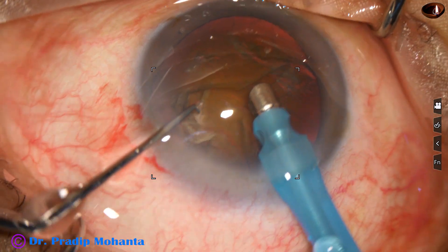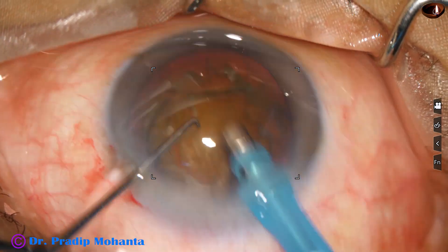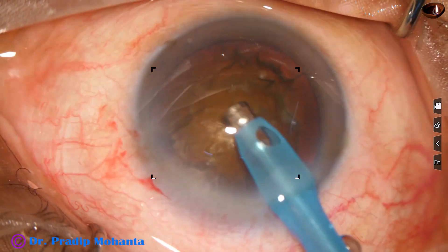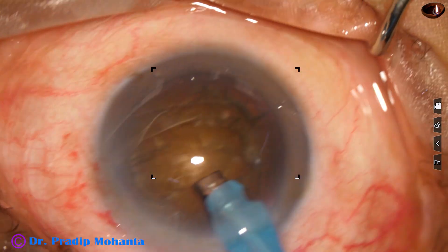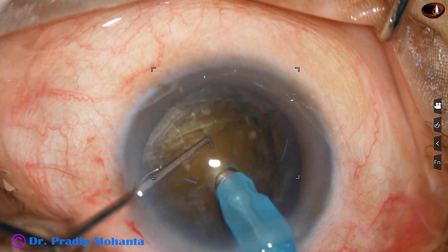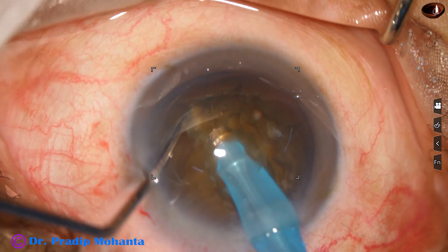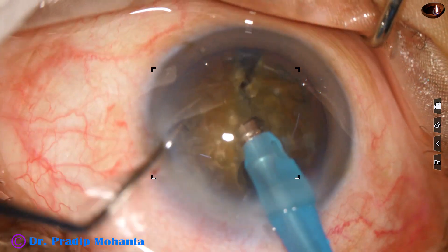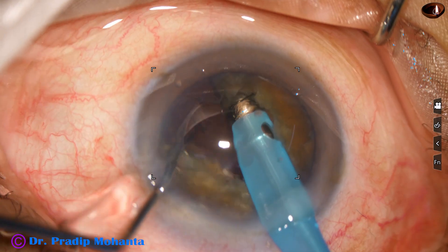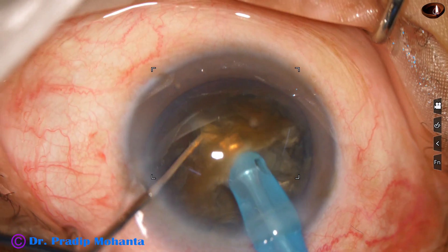Some superficial cortical lens matter is removed. Then the handpiece is turned to make the bevel up. The nucleus is pushed a little down by the chopper, and the tip is buried just in front of the main incision. It goes through the substance of the nucleus towards the opposite equator, and the chopper is used to divide the nucleus as the phaco tip goes near the opposite equator. A 180-degree rotation, and the two heminuclei are completely separated.